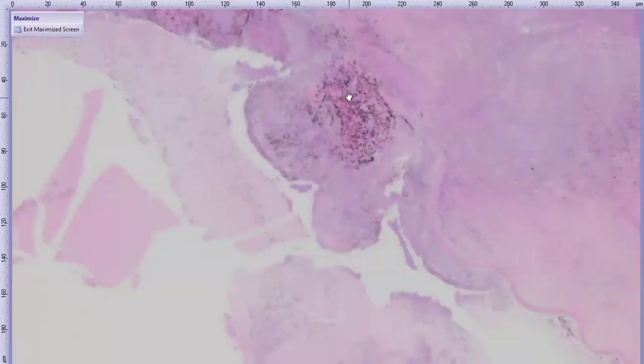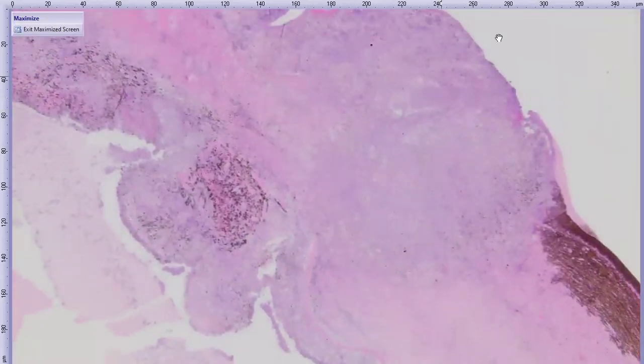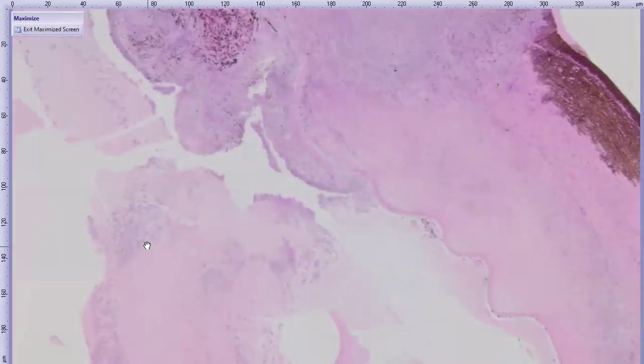All right, so a little bit higher magnification, we can again see all of these cells that are invading the limbal sclera, and the collagen that's actually supposed to be there of the cornea/sclera is kind of lost. We'll look at that closer. Right here over the anterior uvea, we can see that the carpet that would have been kind of white tan grossly is now purple, so lots of cells carpeting the uveal surfaces and also infiltrating the uveal stroma.